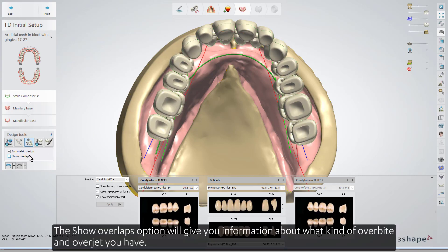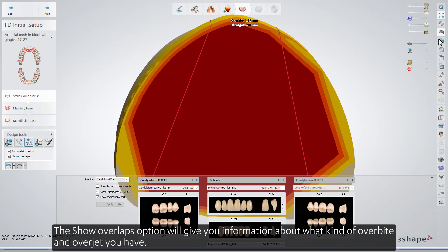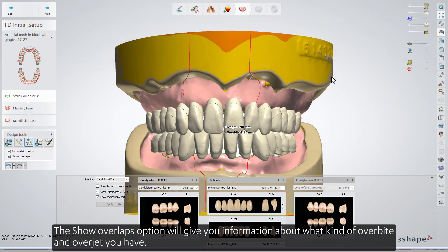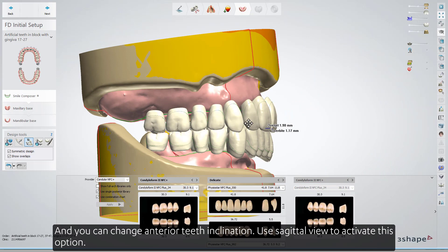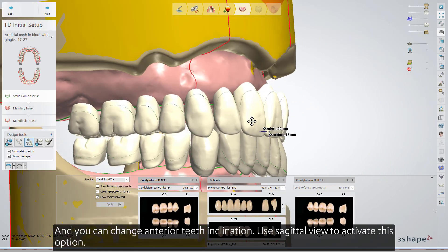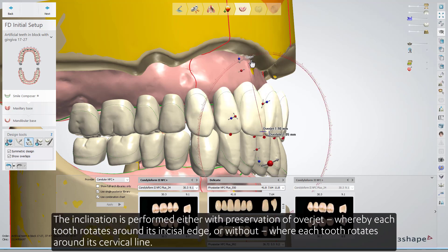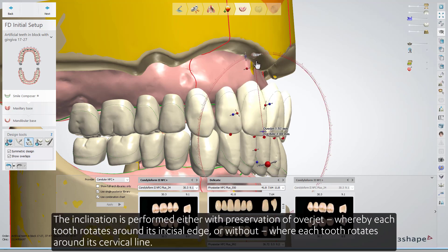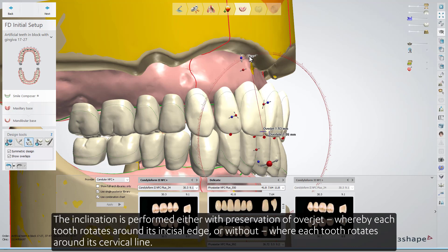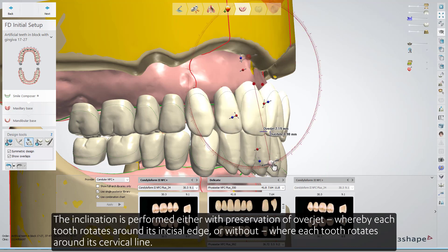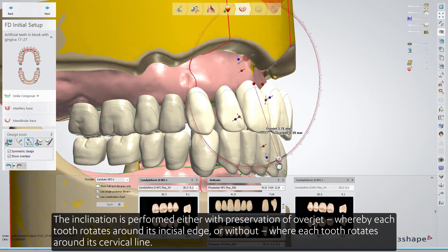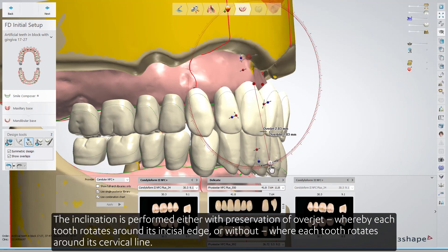The Show Overlaps option will give you information about what kind of overbite and overjet you have, and you can change anterior teeth inclination. Use Sagittal View to activate this option. The inclination is performed either with preservation of overjet, whereby each tooth rotates around its incisal edge, or without, where each tooth rotates around its cervical line.